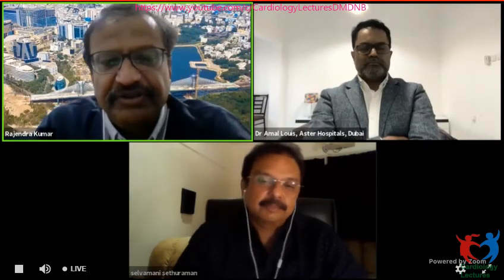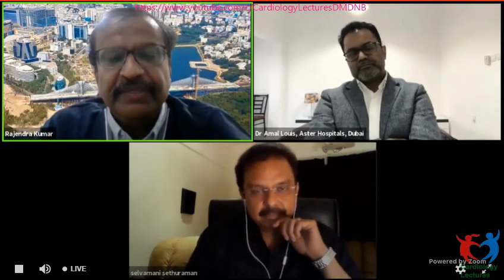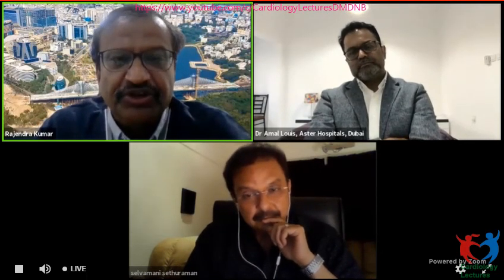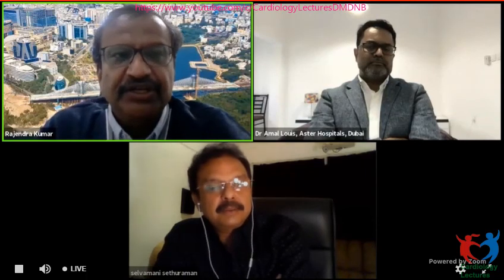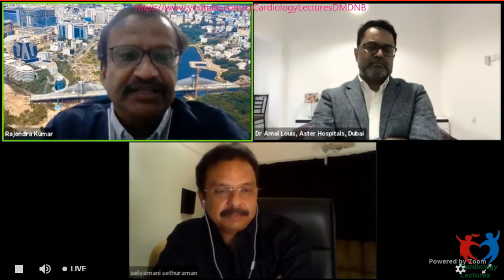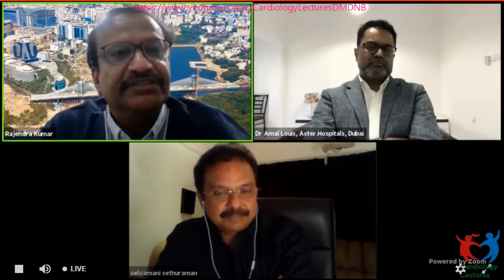Yeah. So that's a very important message, I think, for all the audience. When you have a calcified lesion and you're not sure whether to do a rota plus IVL, what you do is just pass any catheter and balloon, probably do a soft inflation, and if there's no dog bone there, there's no need of a rota. Go for IVL and complete the procedure. That's right. I think that's a nice message, Dr. Selvamani, and a nice tip for all the audience.